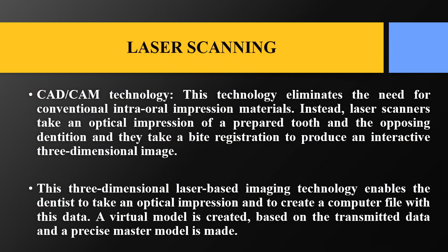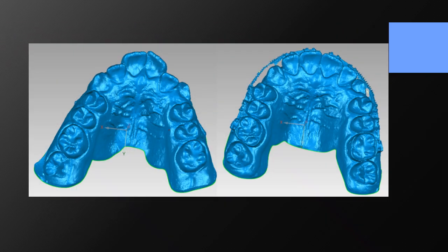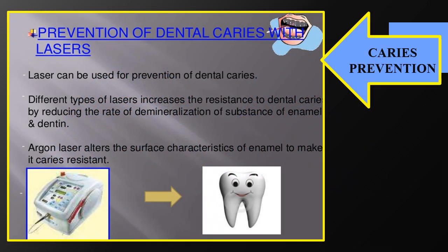Laser scanning, that is the optical impression used in CAD/CAM technology, is used for detection of the occlusal and bite forces and for the bite registration procedure. So this is a representation of the laser scanning of the CAD/CAM devices. Lasers are also used for prevention of dental caries. For example, argon lasers and diode lasers are used for killing the bacteria and for minimizing the occurrence of caries.